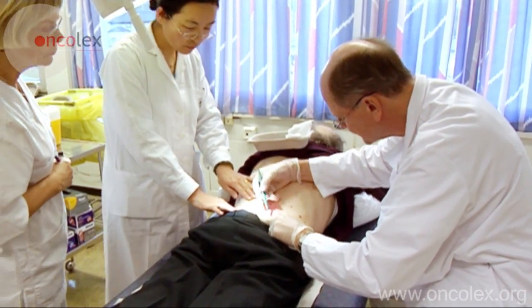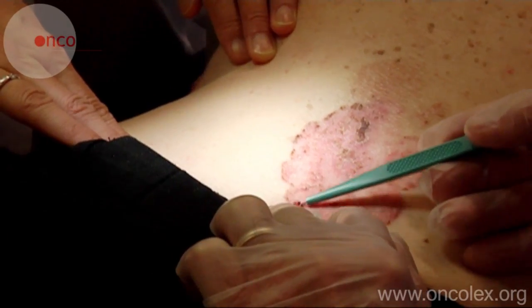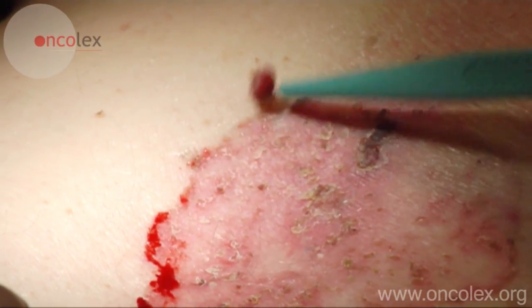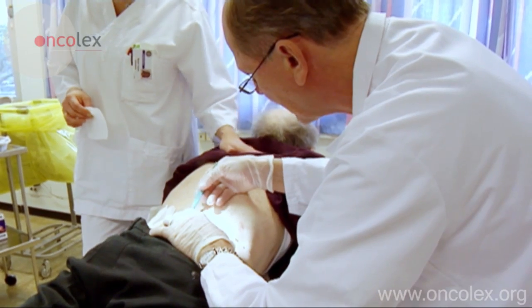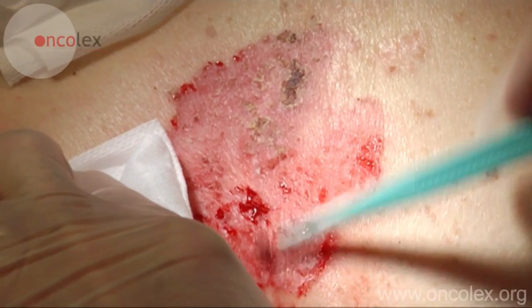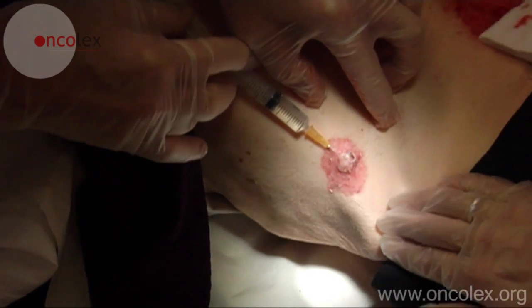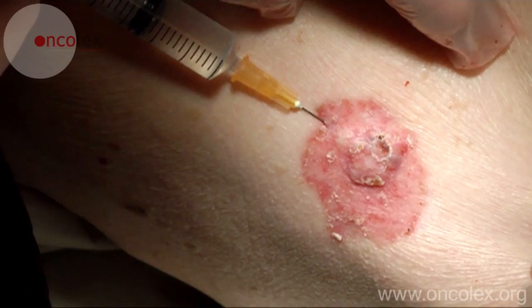The large lesion is scraped. The nodular lesion is thick, so local anesthesia is administered before scraping.